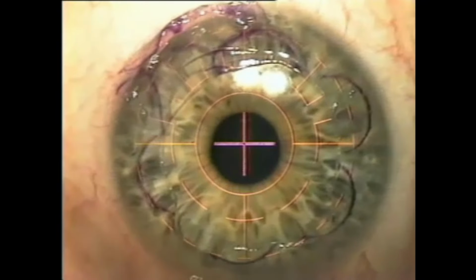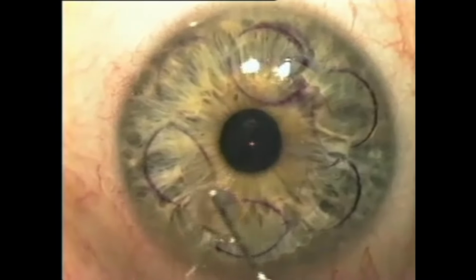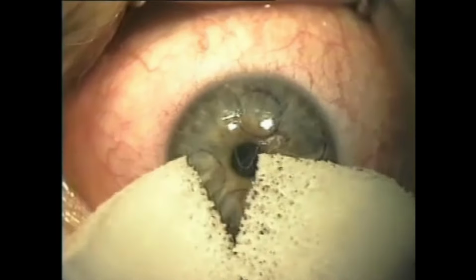The treatment is centered on the pupil. The epithelial sheet is then carefully repositioned, and using a bed of BSS, it can be adjusted gradually until perfect edge alignment is achieved. The epithelial surface is allowed to dry prior to placement of a therapeutic soft contact lens. The contact lens can be gently tapped to ensure adequate adhesion of the epithelium.